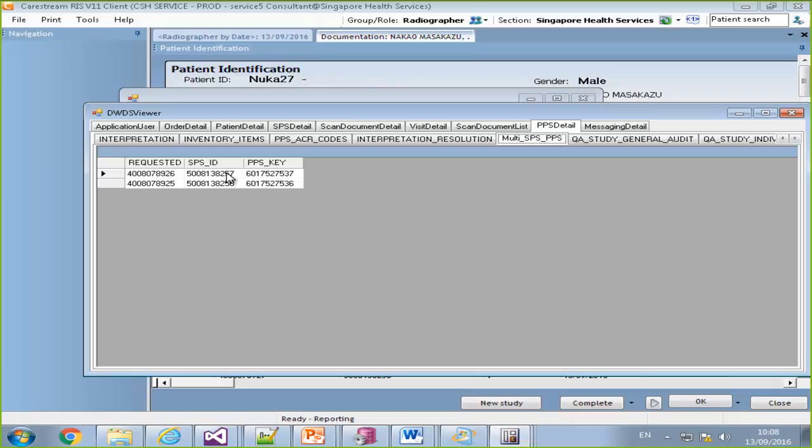There will be some that you don't want to copy because, the tricky thing about this is that we're getting rid of the old functionality, so we've got to make sure we're hitting everything. The one thing I was thinking about is I'm working right now with Bear on radiation dose. Radiation dose, we're applying it at the PPS level.